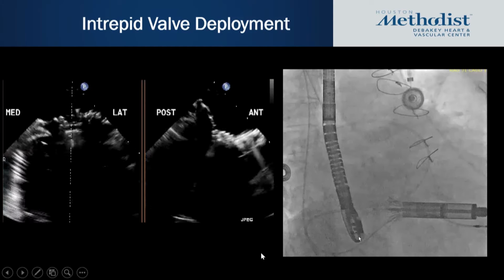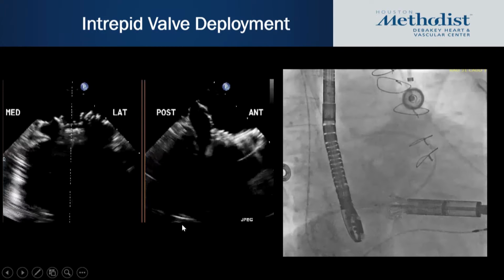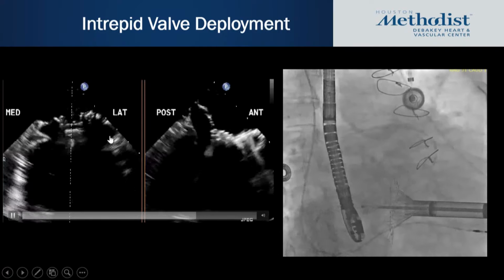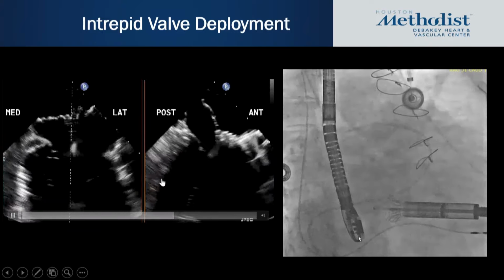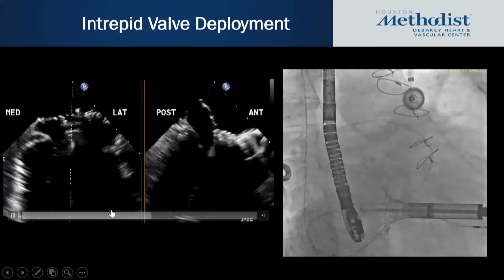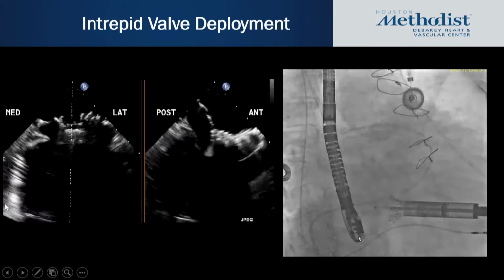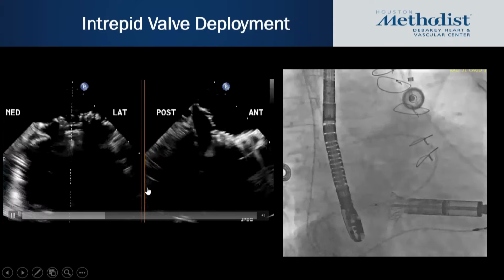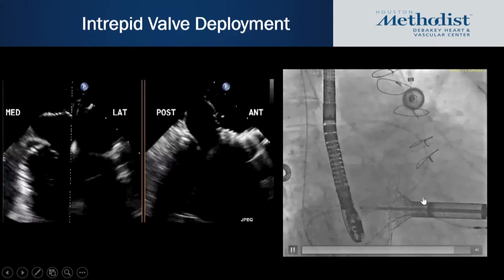Once you confirm the position of the transapical puncture site, the delivery system and the valves are advanced into the LV and then into the LA. It's important to have all your pre-procedural images reviewed because you want to make sure you're crossing at an angle where you're not risking injury to the RV apex or to the subvalvular apparatus. That's where CT can be very helpful in pre-procedural planning of TMVR procedures.